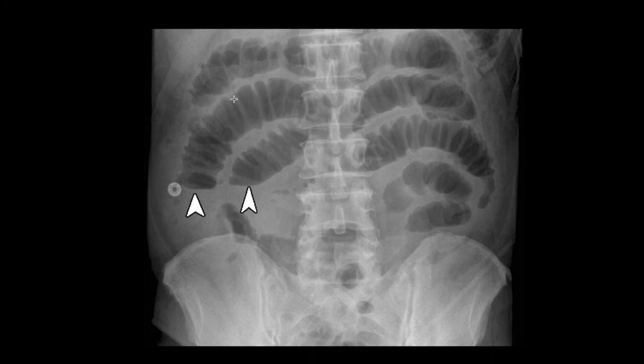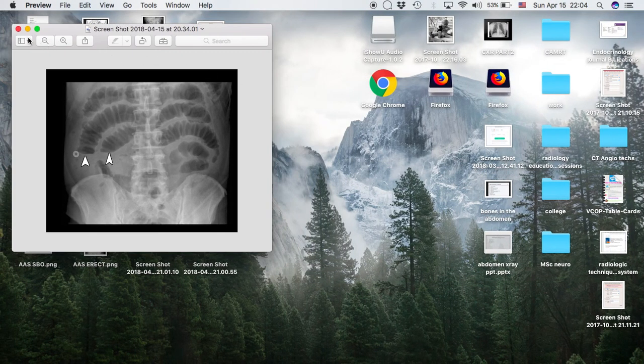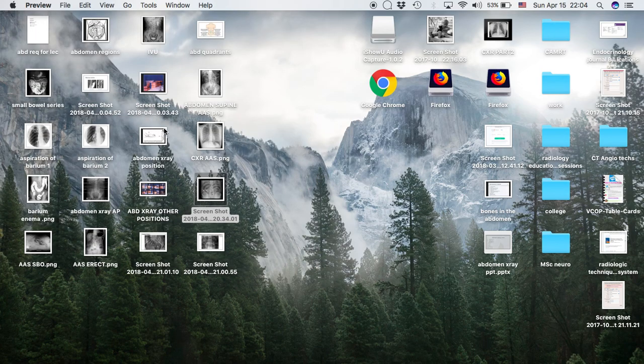And also the wall pattern can be affected by distension, and it has a special wall pattern. It's unlike the haustrations. You can see it right here. It's unlike the haustrations seen in the large bowel. Okay, now coming to another thing. Let's see, I'm not quite sure I actually snapshot the values. Okay, unfortunately, I wasn't able to snapshot them, but I will explain here under the radiograph.